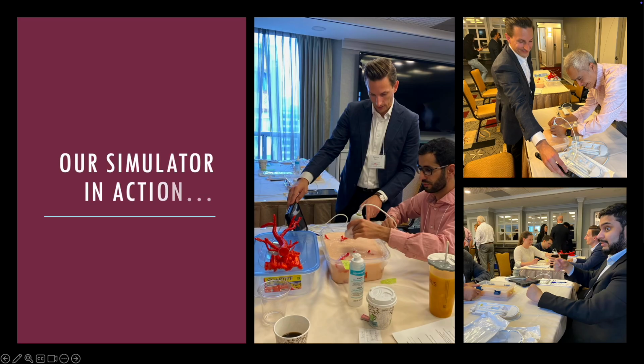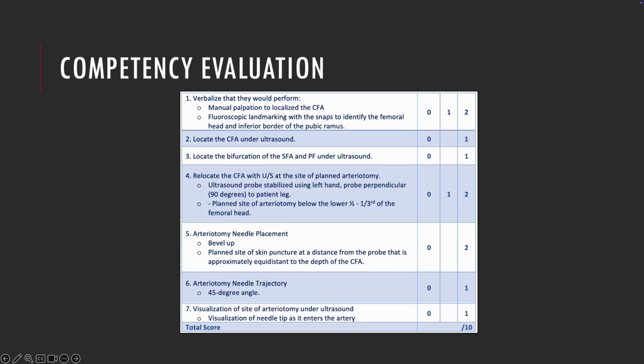Our simulator has been used across Canada and has been used to teach over 100 trainees over the past 2 years. Several iterations have been evaluated, and we're on our 4th iteration of the model currently. For competency evaluation, trainees will typically be sent a 5-minute video on best practices for safe femoral access, and then they will, under direct observation, perform femoral arterial access in front of an educator. This checklist will be used to mark them on their process. On average, trainees will score 8 out of 10 on the femoral access checklist after watching the femoral video. 97% of our fellows were able to correctly identify a high or low bifurcation using our models.